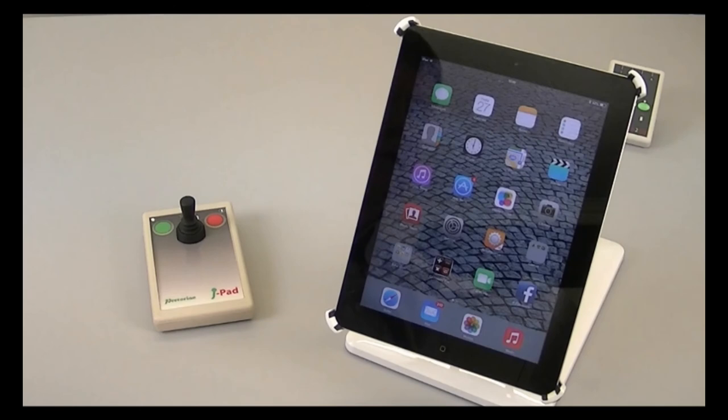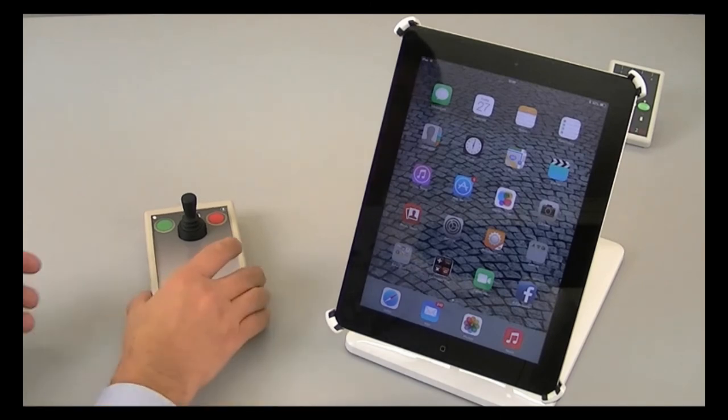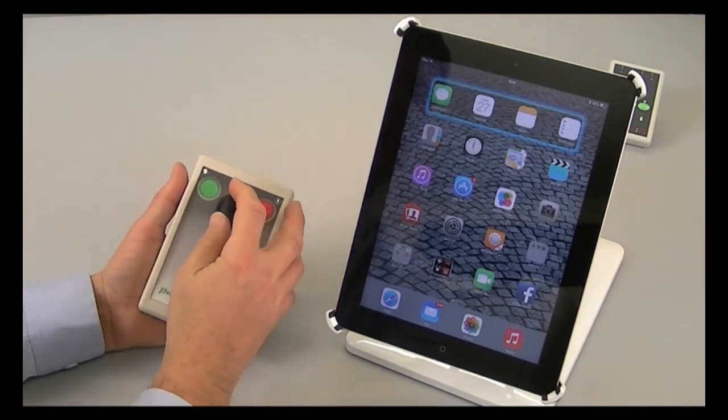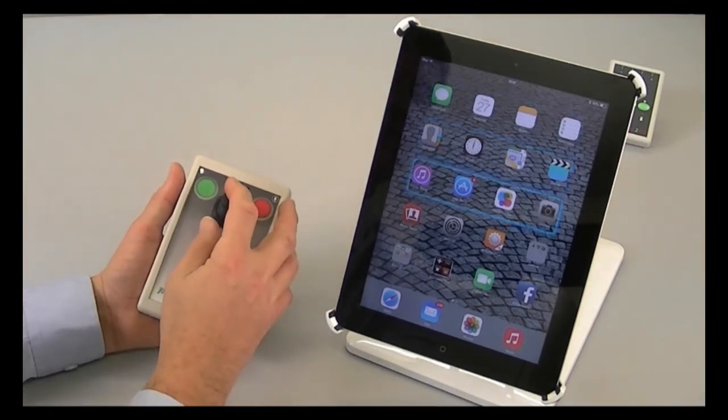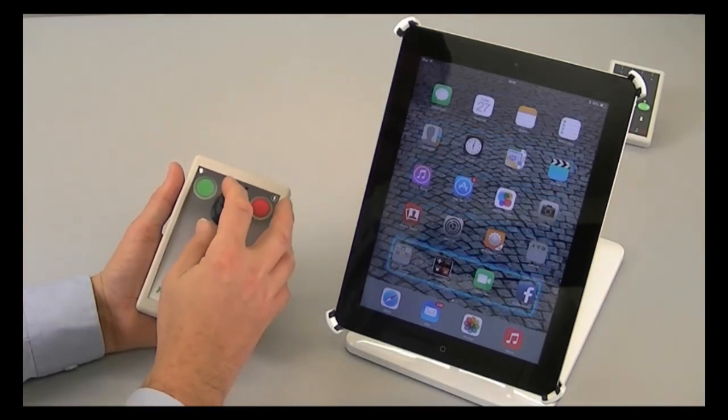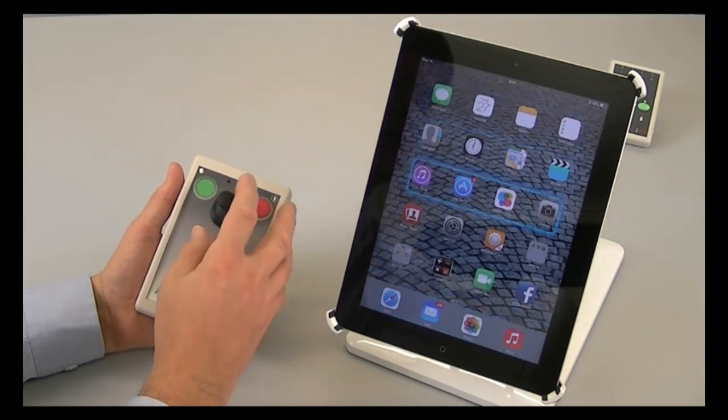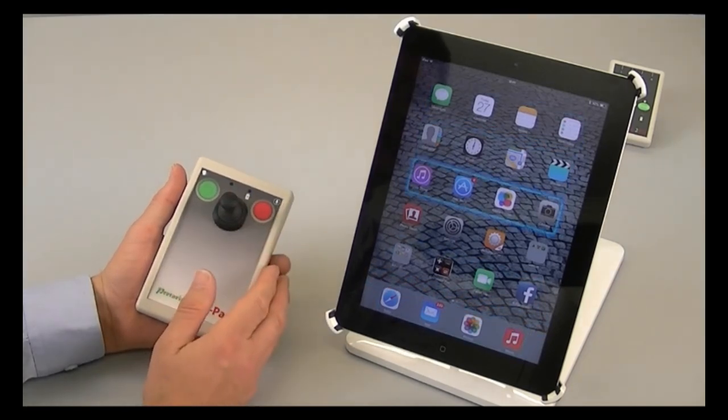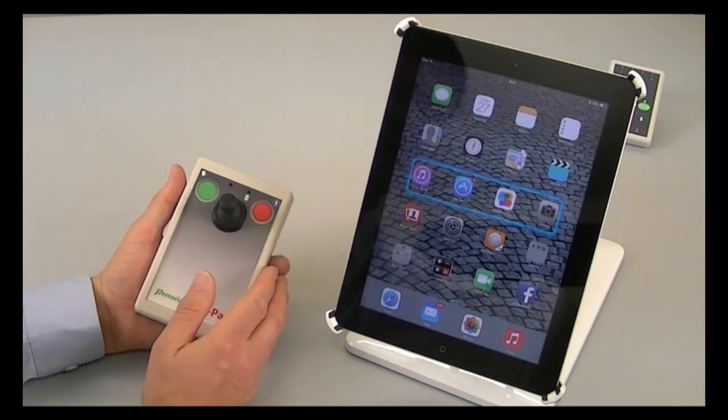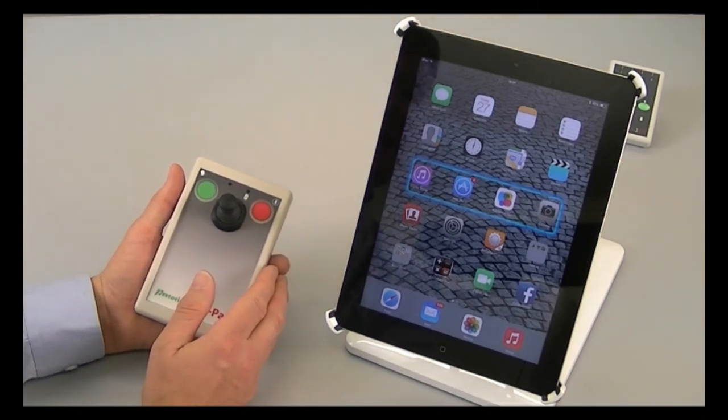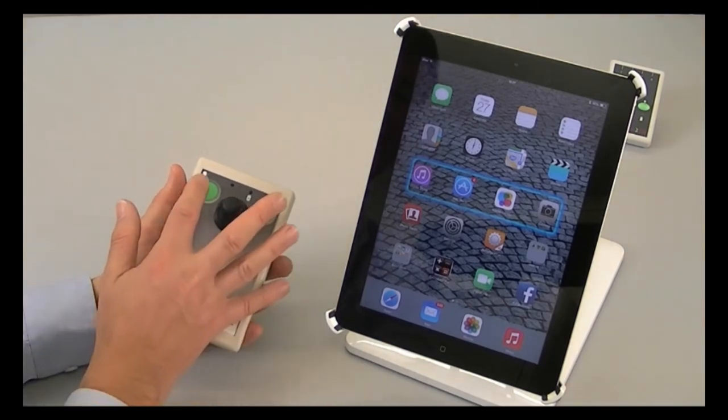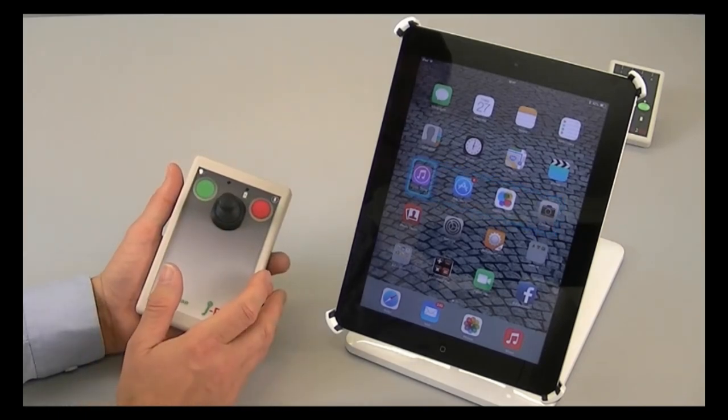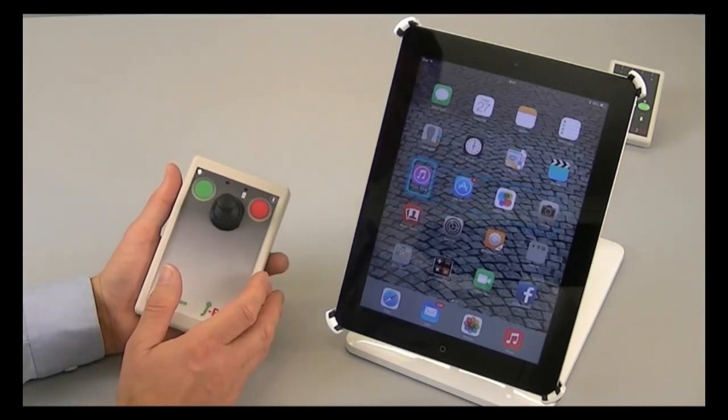Now I'd like to give you a quick demonstration of how J pad can be used with switch control. If I move the stick up or down, that allows me to scan line by line until I get to the app that I'd like to launch. In this particular example, I'm going to launch the camera app. Once I get to the line, if I press the green button, then I can scan within the line.